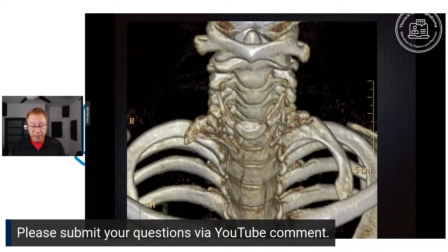You can do things with CAT scan like make three-dimensional images. This one has a big cervical rib on your right side, the patient's left. And, you know, for many surgeons, seeing in 3D is much easier. Radiologists do this all the time. Surgeons don't. So when we can make 3D models like this, it helps out a lot of people.